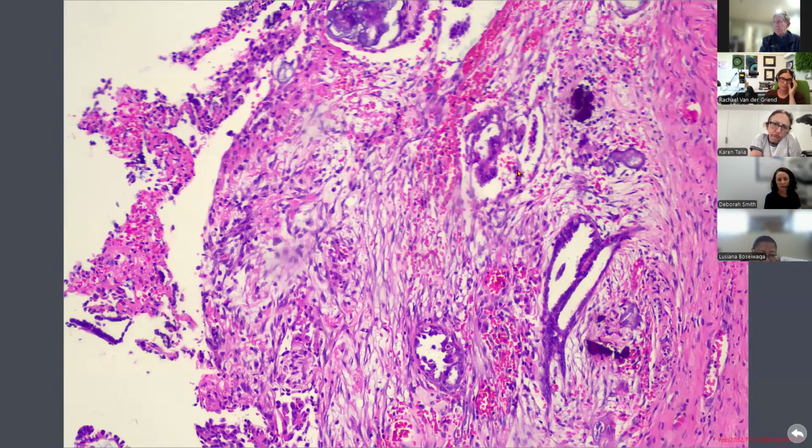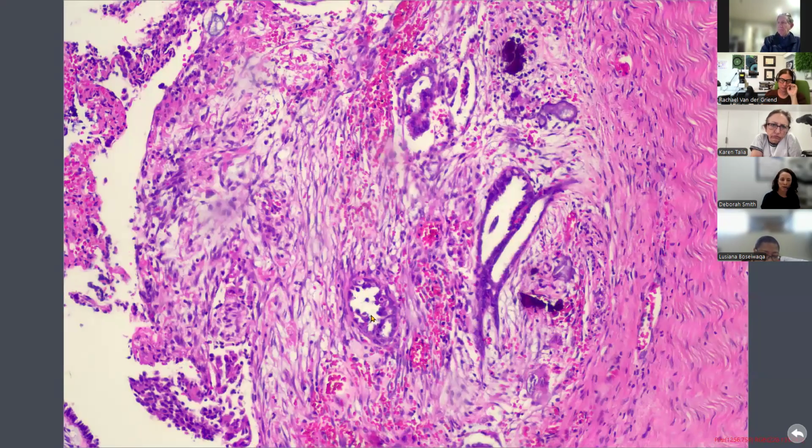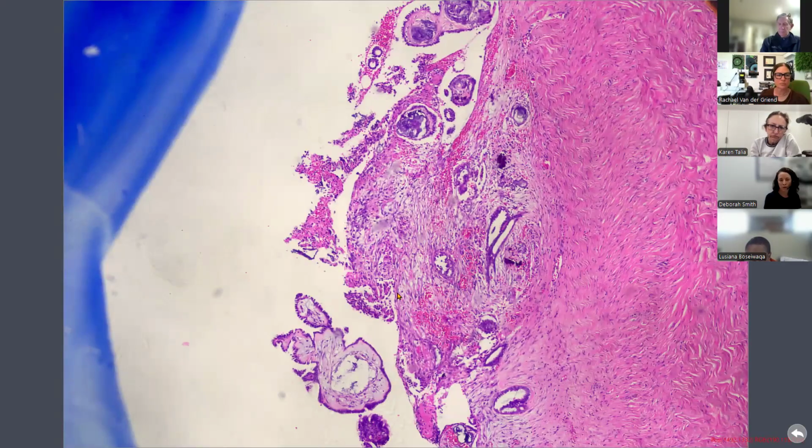We've got epithelium that still looks a lot like we see with the borderline tumor, where it starts to sit within the granulation tissue stroma. It almost blurs the epithelium in with the stroma. So although it first looks like it could be metastatic carcinoma, because that's what we often see on the surface of things in the context of reactive stroma, in this case, this is just a non-invasive implant, or autoimplant, on the surface of the ovary.